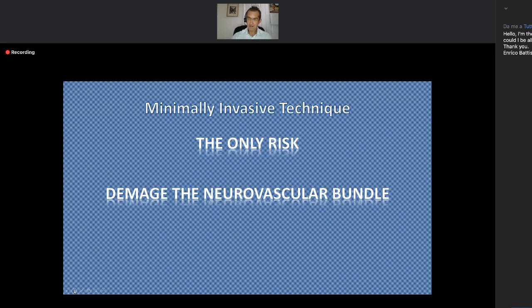Yes, for sure. I am really in love with the infrapubic technique. I think it's a very, very nice technique. I enjoy every surgery I do. I think it's not so challenging. I agree with Gabriele that the risk of damaging the neurovascular bundle is very low. And I think that probably, yes, 40, 50 penoscrotal procedures before you start with the infrapubic approach, it's okay.